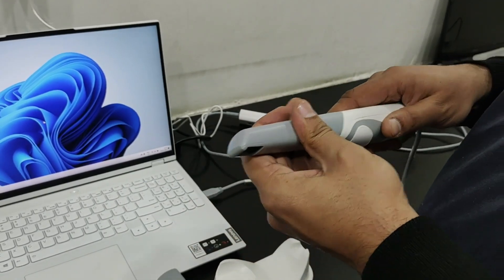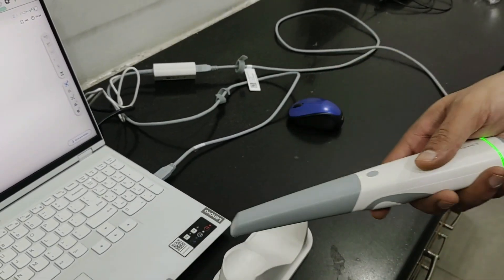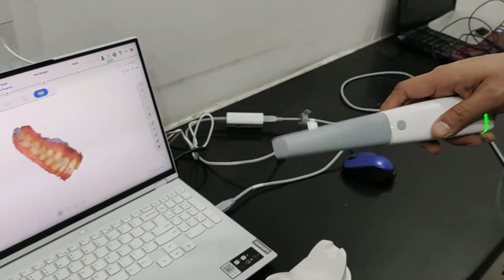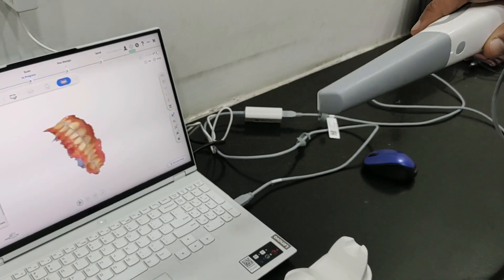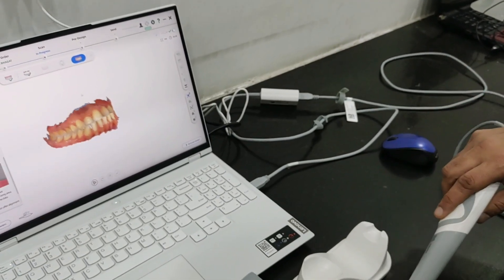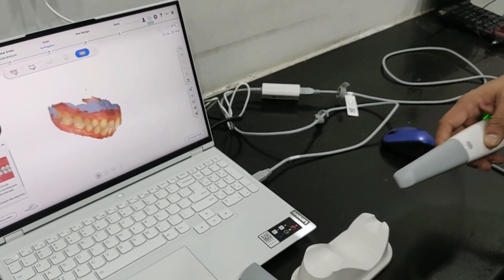There is a function of air mouse as well — you can use this scanner to move the models on screen. It has a gyro control kind of thing. As you move this, we can show it to the patient by moving the scanner itself — we don't even have to touch the laptop. Moving the scanner itself, we can move the scans on the screen. It's a very nice feature; once you get used to it, it may be very helpful.